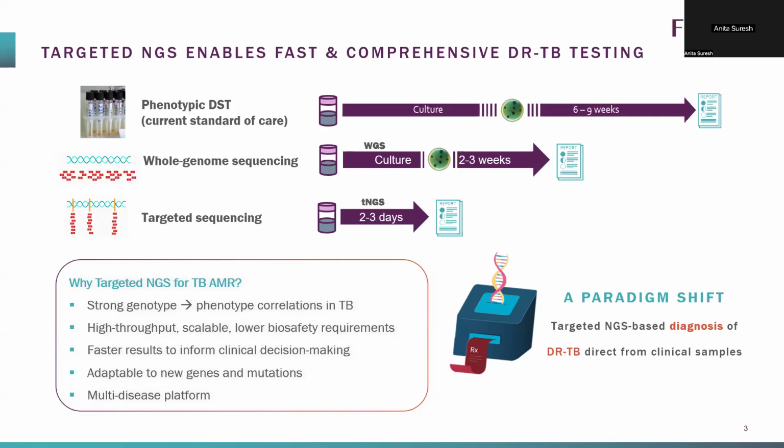And overall, I think the value of sequencing platforms as a multi-disease tool can't be overstated. That's another big value that ministries of health and health programs are seeing and utilizing, saying we bought it perhaps for COVID, but we want to be able to utilize it for our current disease priorities in the country.